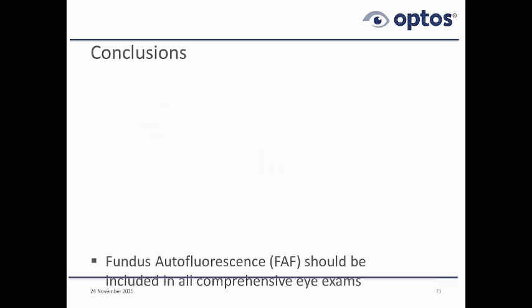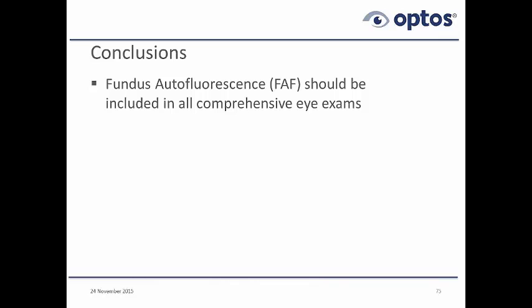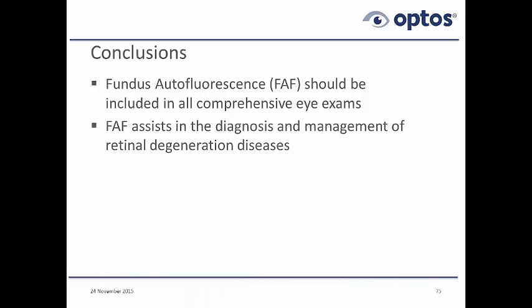Okay, we're about out of time. Let's conclude a few things. We'll say that fundus autofluorescence should be included in all comprehensive eye exams. As long as you have, say, a Daytona and you're taking color images, you might as well go ahead and do the autofluorescent images as well, because you never know, you might see things that are going to completely surprise you.